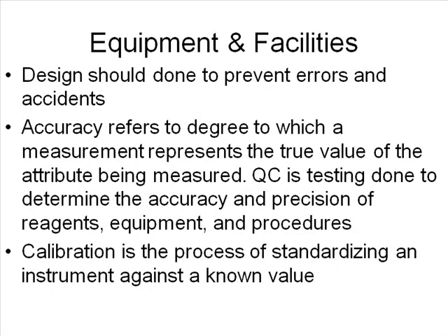All right. Remember too, and we talked about design of the blood bank, calibration of the instrumentation. Remember that centrifuge that you're using to do ABOs must be calibrated so that you know you are correctly centrifuging. If you're using gel, remember there is a correct QC amount of centrifugation, incubation, for all of that.